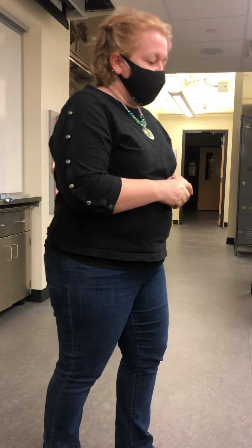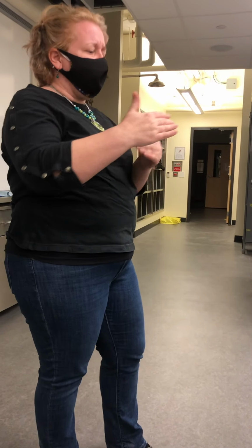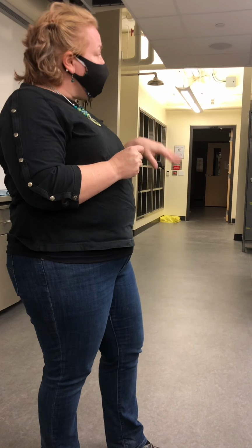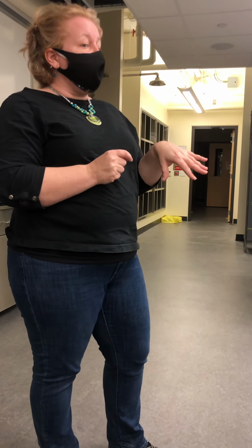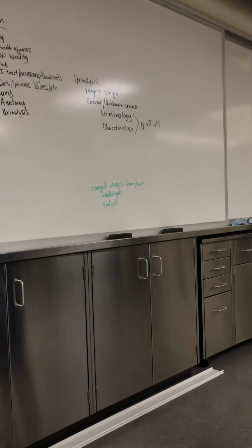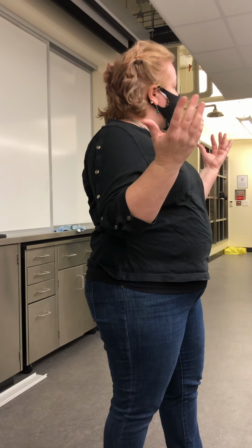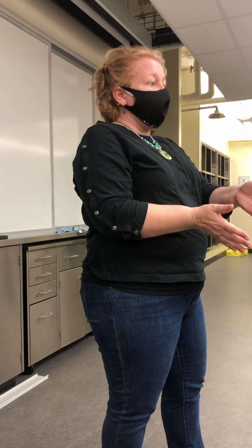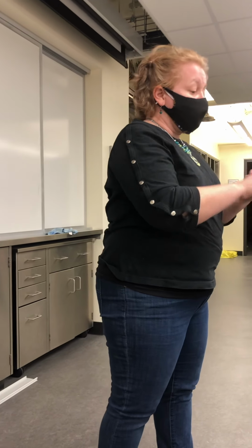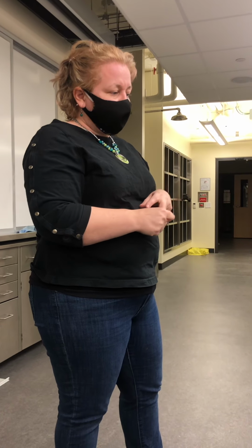And that usually is diabetes mellitus. But I must say, most of the rest of these could indicate various different things, depending. So your job, when you are looking at a glucose strip, when you're looking at a reagent strip, is simply to say, they have elevated levels of such and such. It's called this, so that's what we expect of you in lab. We expect you to be able to determine what is elevated and what the condition will actually be called.